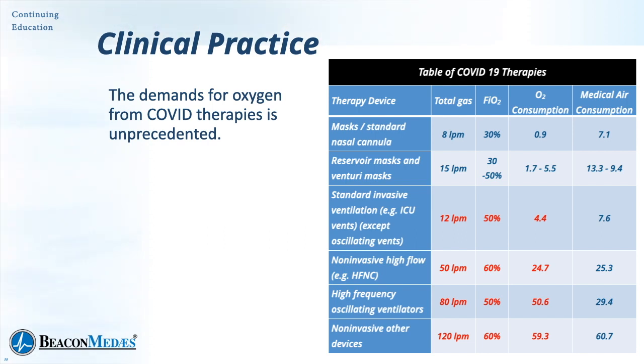With reservoir masks, Venturi masks, and standard nasal cannula, we can often do that with a Venturi, where we're going to simply feed the patient oxygen and the air component is going to be drawn in through a Venturi. We don't actually ever connect them to the medical air at all.